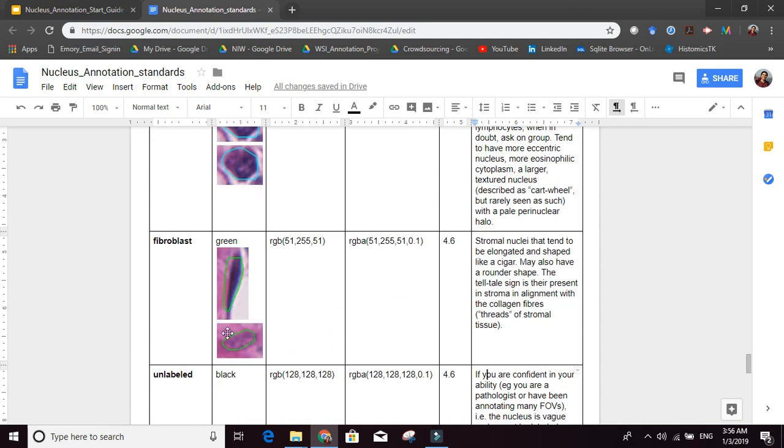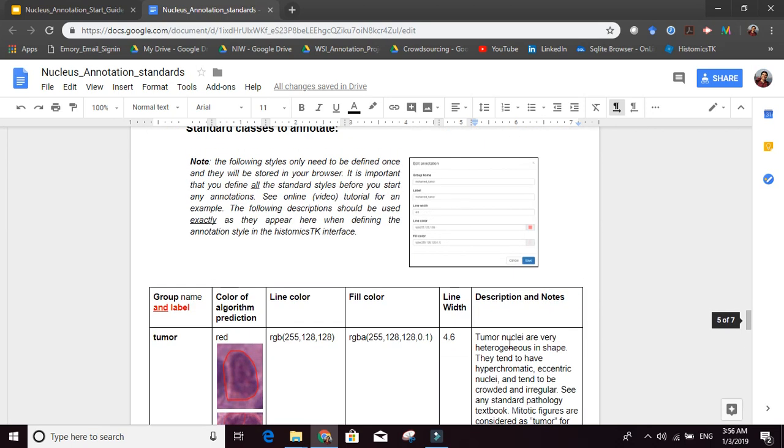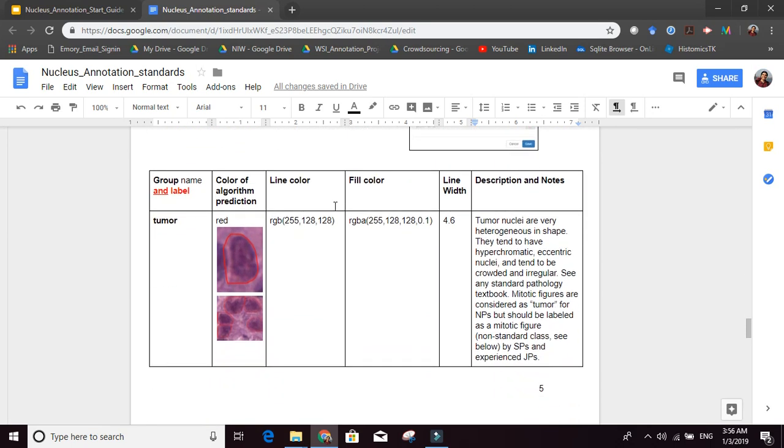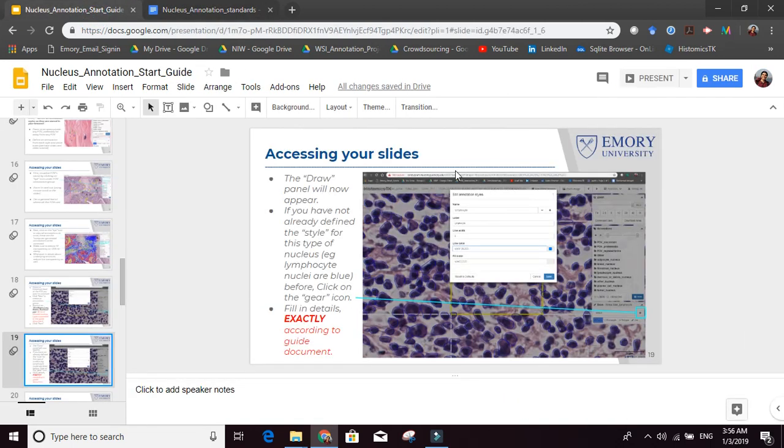What it thinks is a fibroblast is green, and everything else is black. You will notice that your colors are actually going to be similar to the computer colors, but a little bit different. And they're different for a reason. They're different just so that you can clearly see what is generated by the computer and what is generated by you. Okay, so getting back to the presentation.